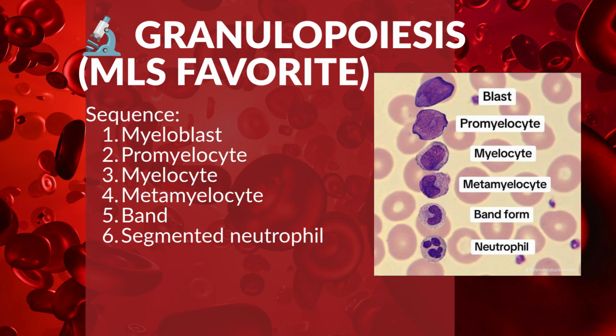So a myeloblast is the earliest recognizable granulocyte precursor. Bam. Cyclops. You're going to see that dang eyeball looking dead at you. Myeloblast: very large nucleus, fine chromatin, nucleoli present, very little cytoplasm, no specific granules. None whatsoever. It actually looks like, what are we doing here? Why is this cell here? And it don't look right. Now if I see more of those, I'm going to get suspicious, because I should not see a cell without much cytoplasm.